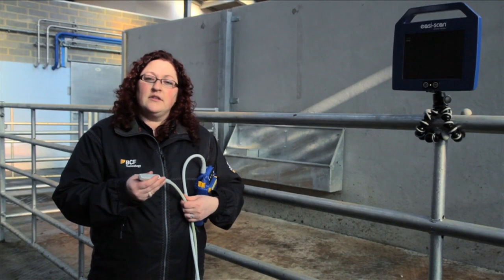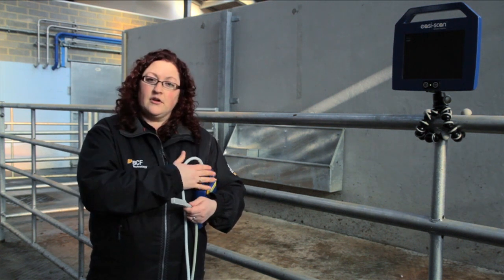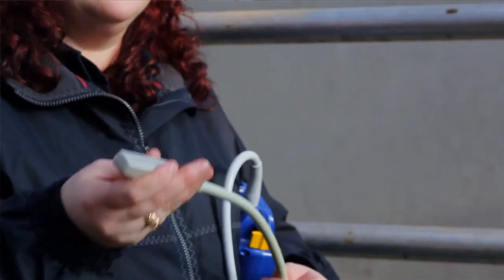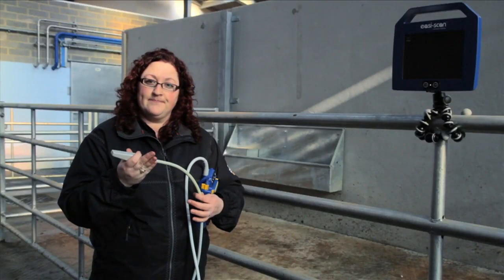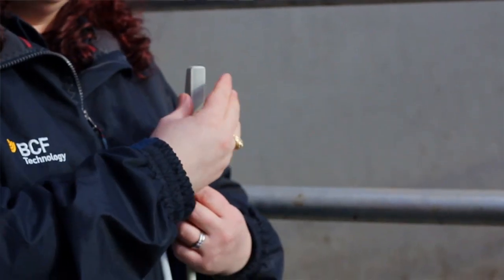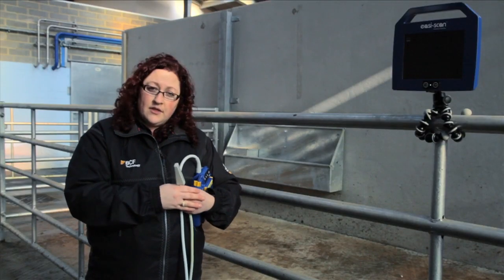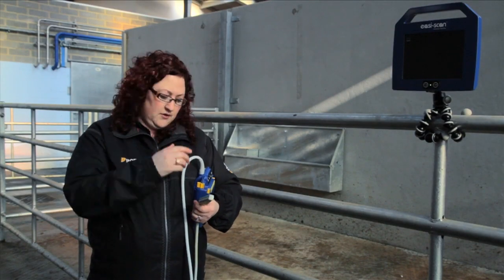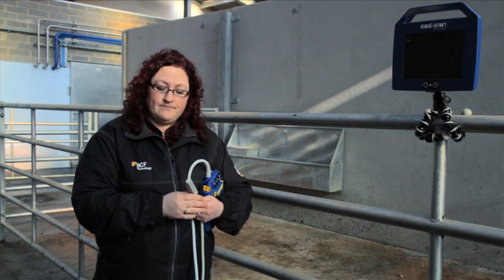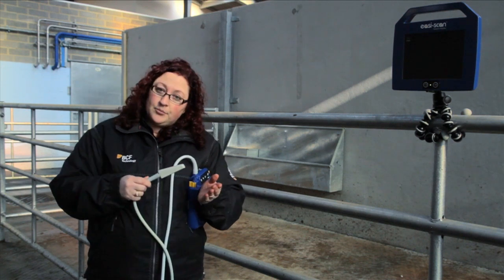So next, we will be looking at the next component of the ultrasound machine setup, and that is the probe. We've already looked at the console, and now we will be looking at the probe, which is the actual information gathering device of the setup. The probe is what actually goes inside the cow and releases ultrasound waves, which will then interact with the tissues within the cow and then send back a signal to be recorded by the console, which will ultimately give us an image.